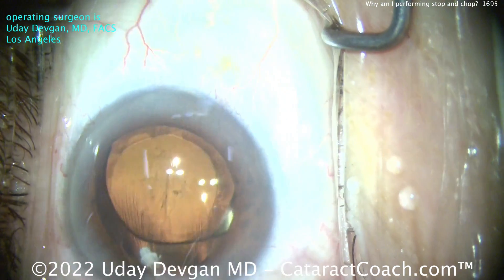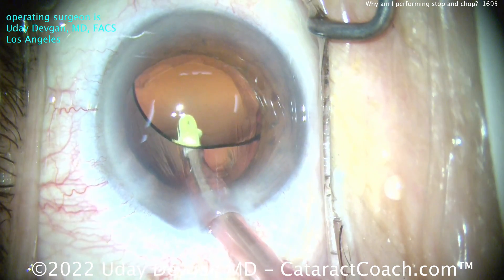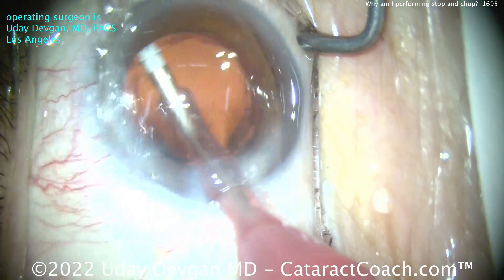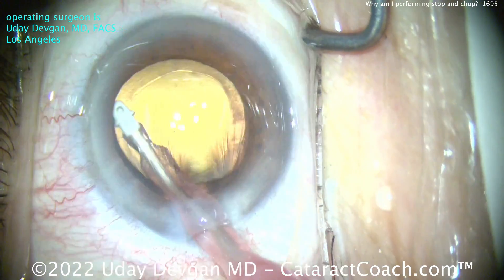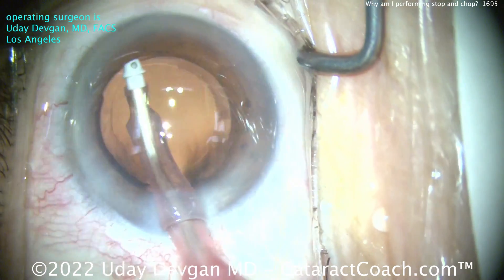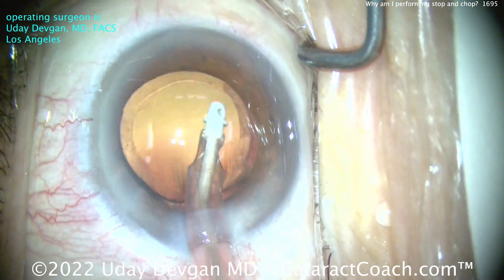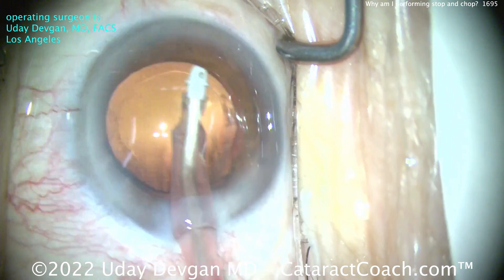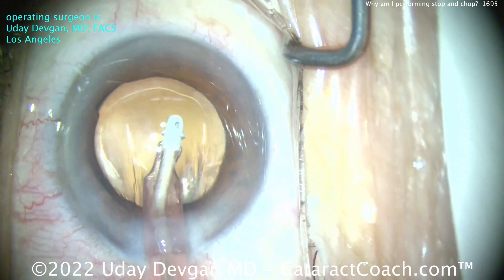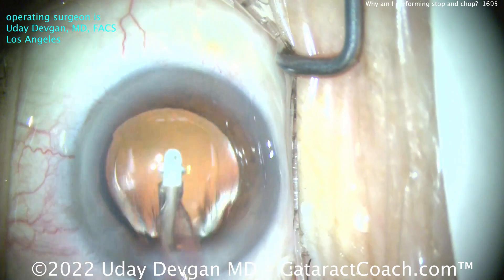Using the chopper to clean up some of that anterior capsular rim material, and then we'll use the IA probe to aspirate and polish the undersurface of the capsule rim. First, let's get the viscoelastic out from behind it. There you go. I'll use a higher flow setting, and now I can polish the undersurface of that anterior capsular rim. We get the hater comments all the time explaining how the armchair jockey is better than the actual player. Cleaning up the viscoelastic here, cleaning up that anterior capsular rim.